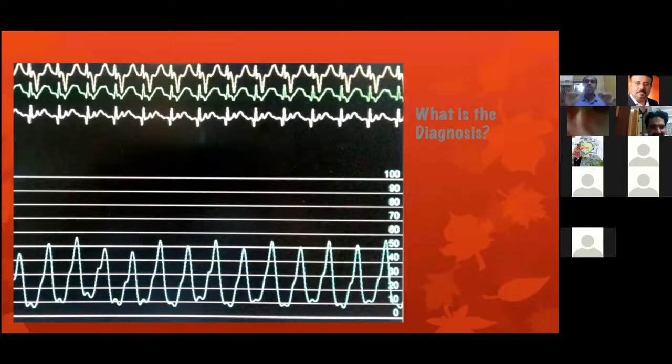This patient is now in the younger age group. As this patient gets more and more advanced in age, right ventricular hypertrophy happens due to pulmonary arterial hypertension. This right ventricular hypertrophy elevates the right atrial A wave. When the right atrial A wave becomes taller, it reflects onto the left atrium also. So A is equal to V as long as the heart is compensated. A becomes taller than V whenever the heart decompensates.